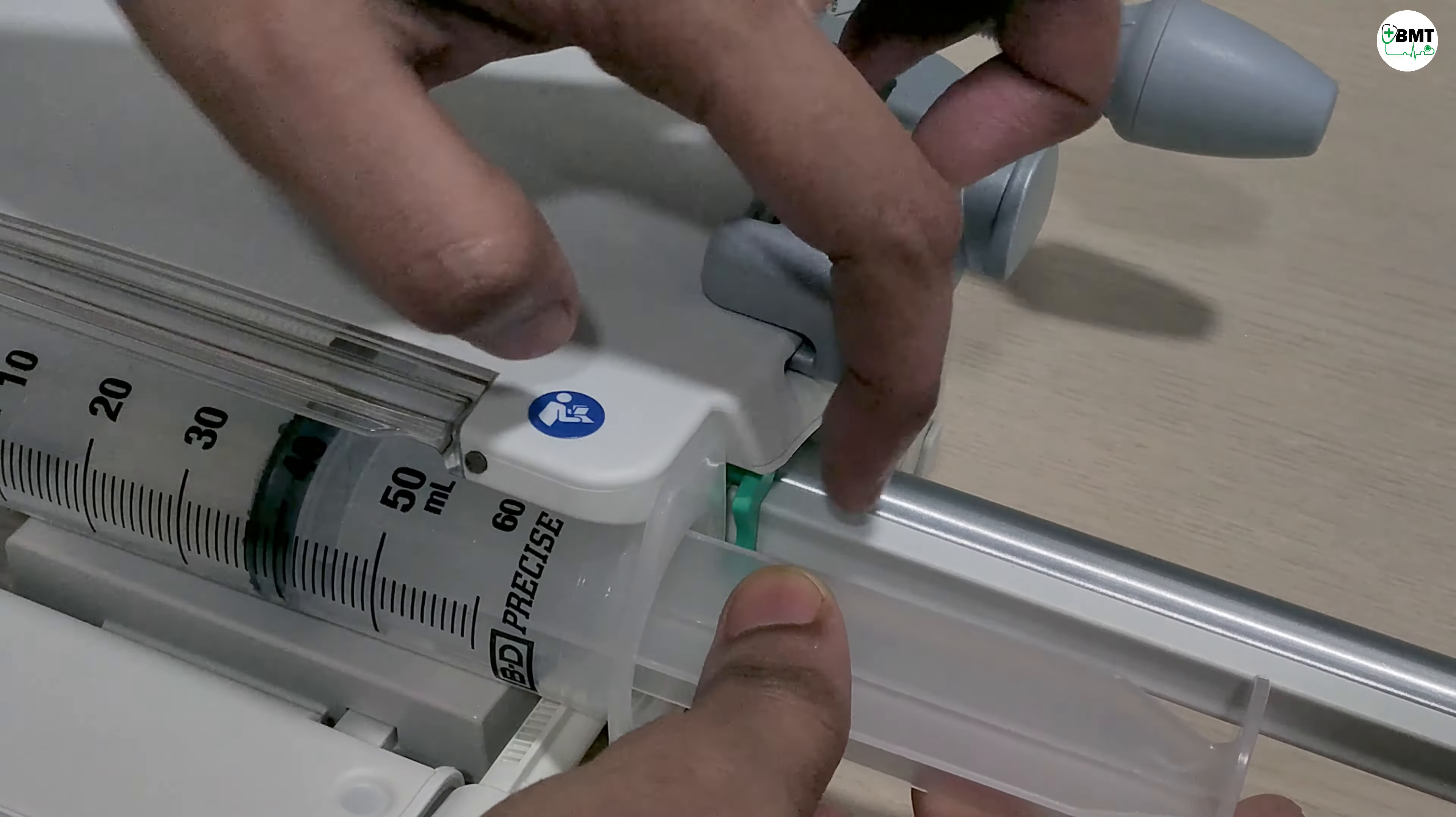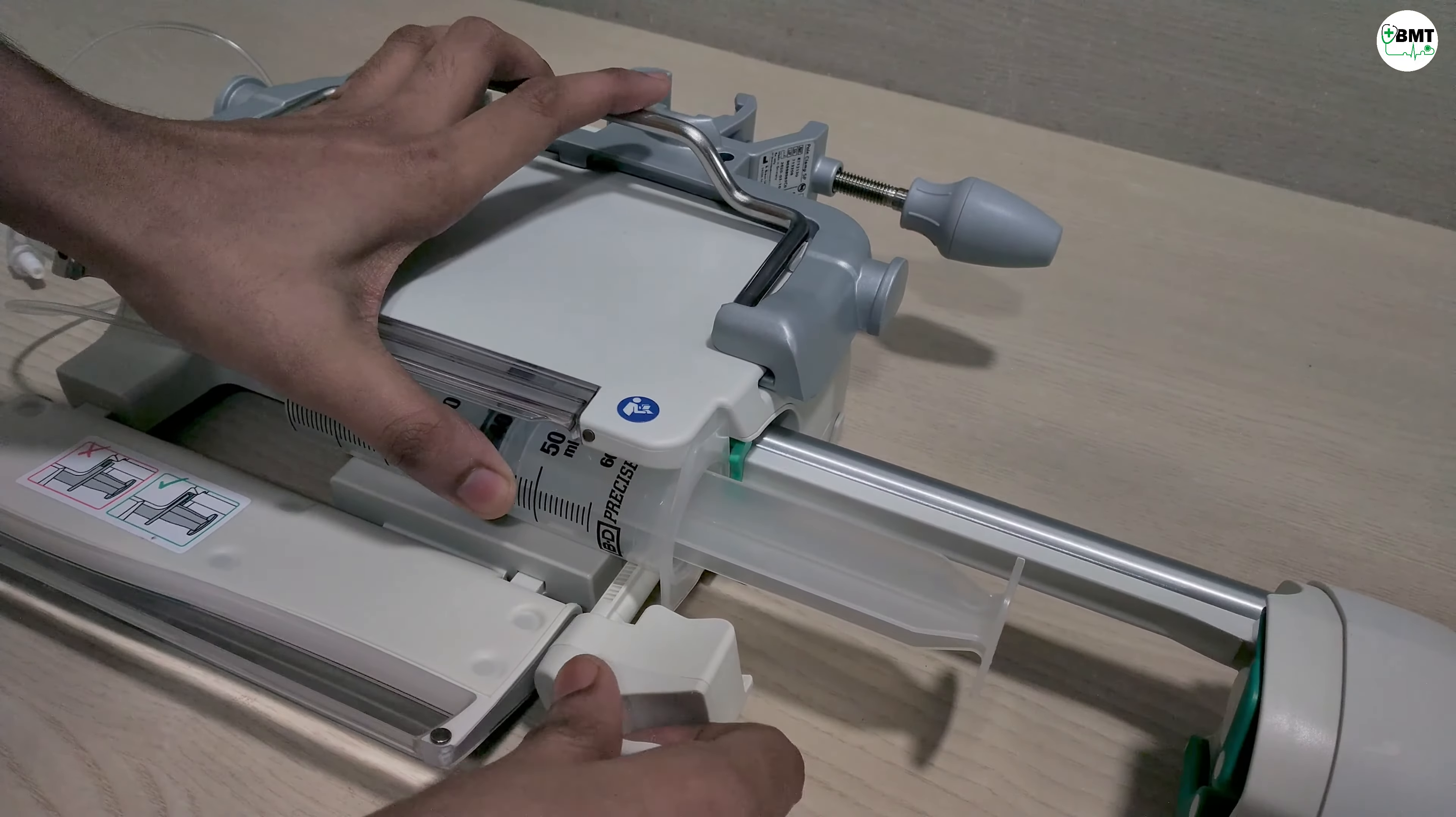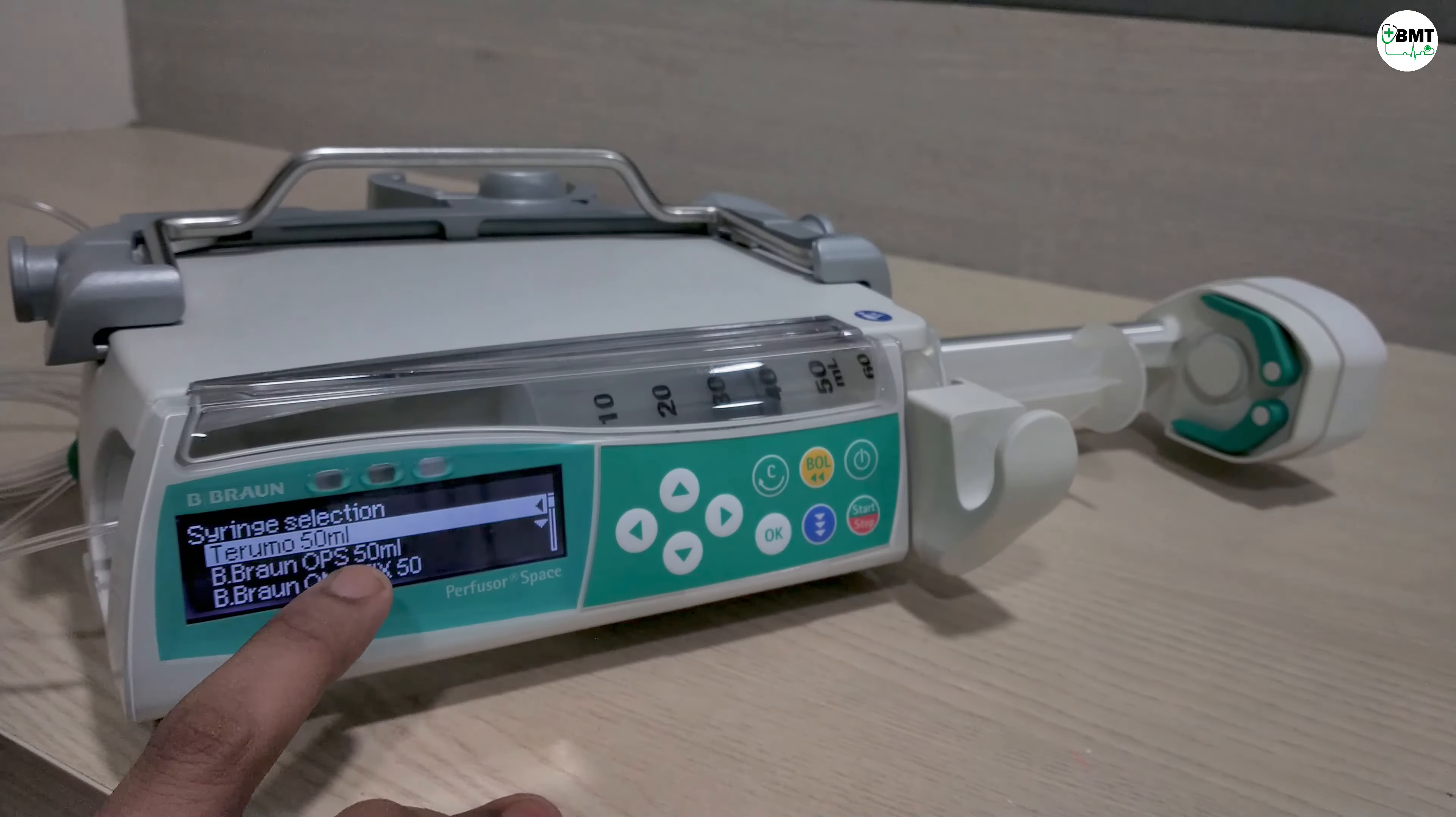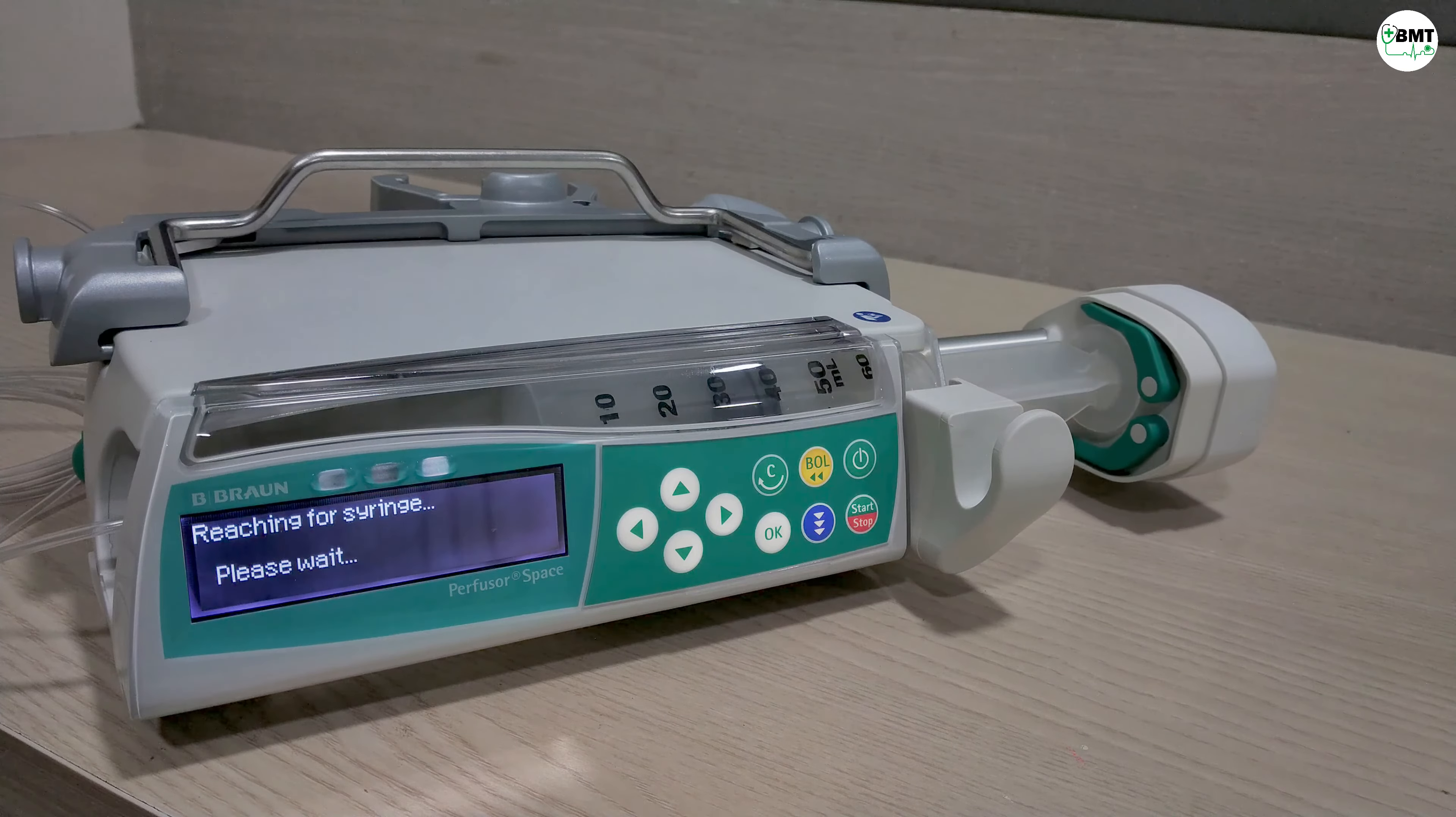This notch should be inside this. Then once placed, close. Select the syringe, then press OK. The syringe will then automatically get adjusted.